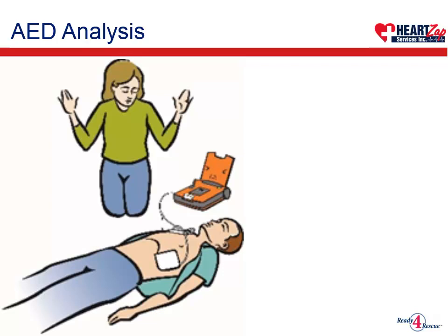If the AED advises you to push the shock button, say the word clear, nice and loud to ensure no one is touching the casualty. If no shock is required, it will prompt you to start CPR and follow the prompts.